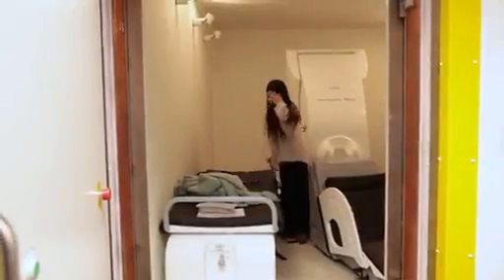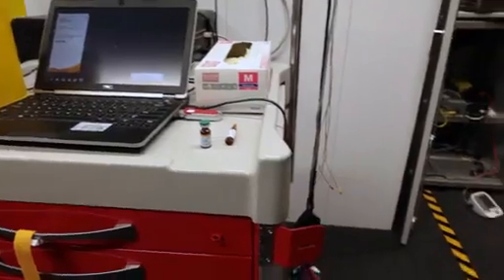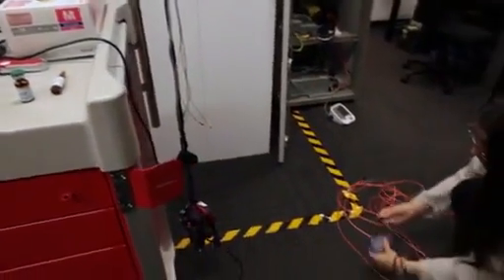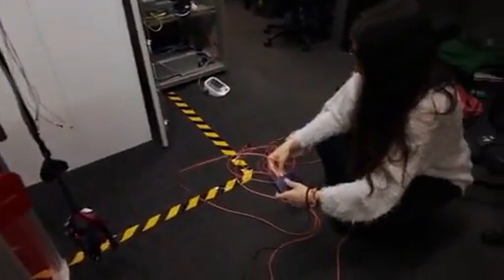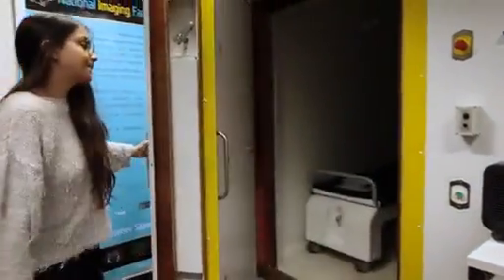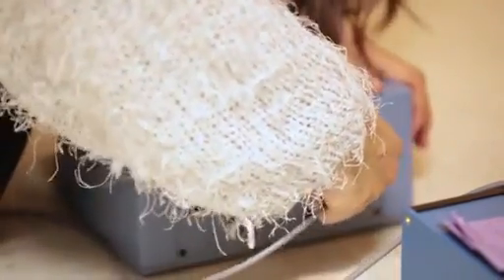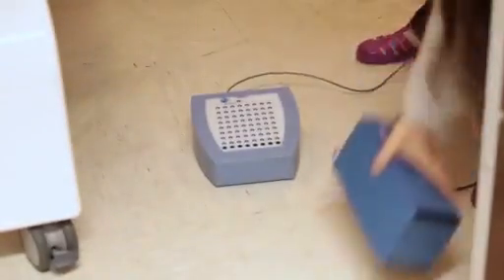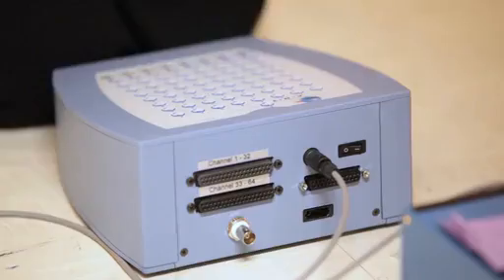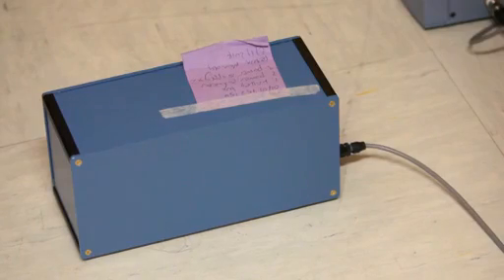Due to the complexity of the experiment, it is important that the majority of equipment setup occurs before participant arrival. The most important of these is the configuration of the EEG system in the magnetically shielded room, or MSR. The EEG amplifier is placed in the MSR as far as practical away from the participant, and needs to be configured to run on DC power using either a built-in battery or an external shielded battery box.